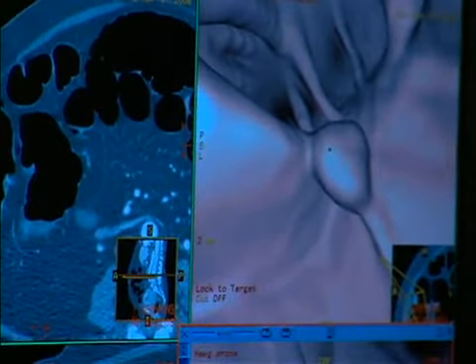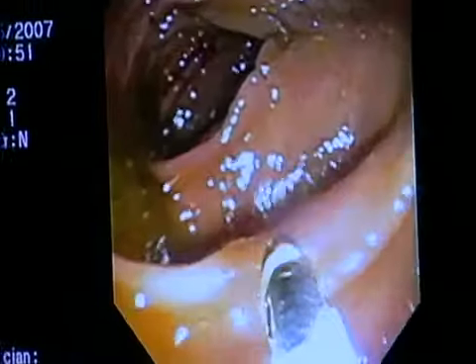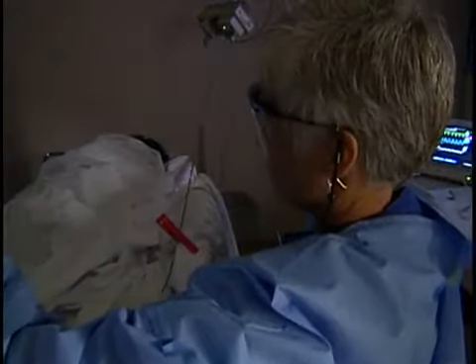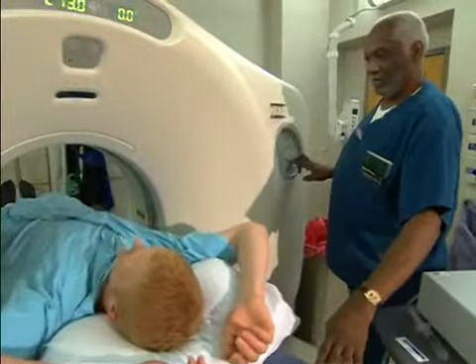If cancer is found, patients will then have a traditional colonoscopy so doctors can take a biopsy. That test remains the standard for people at high risk, but for people at average or low risk, virtual colonoscopy may be an easier option. Dr. Fletcher says the test may get even easier in the future as it may be done with limited bowel prep. He also says CT colonography has proven to be just as effective as traditional colonoscopy at detecting most cancers.